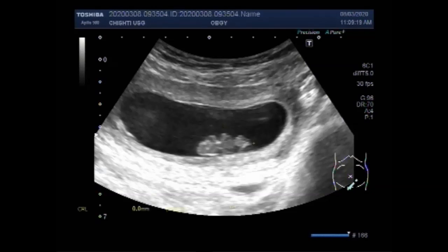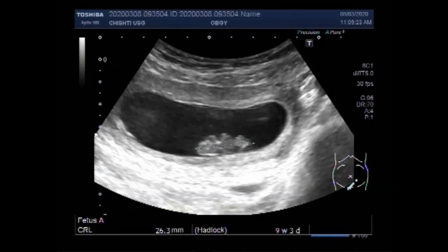Now you can see the measurement of the gestational age of the fetus, and it measures about 9 weeks and 3 days.